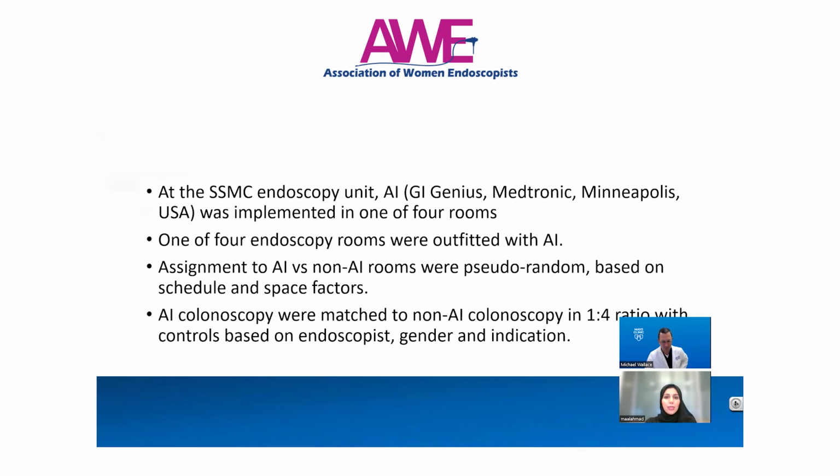So at the SSMC endoscopy unit, AI GI Genius was implemented in one of 4 rooms. Assignment to AI versus non-AI rooms was pseudo-random based on schedule and space factors. AI colonoscopies were matched to non-AI colonoscopies in a 1:4 ratio with control based on endoscopist, gender, and indication.